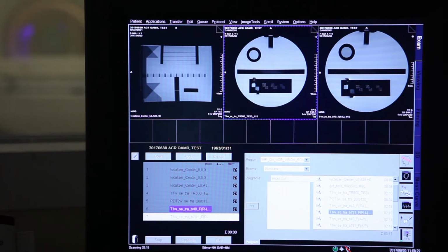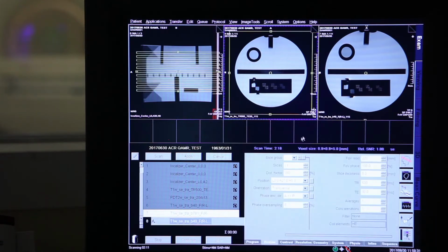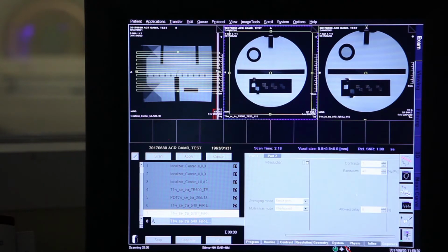As we already told you, I'm going to actually show you what I told you now. So I have it there, the lower bandwidth. I'm expecting to have a water fat shift of 5.2 pixels. So this 5.2 pixels is this actually, in this direction. This image will show the chemical shift, while the other one will not, since it was less than 1 pixel.